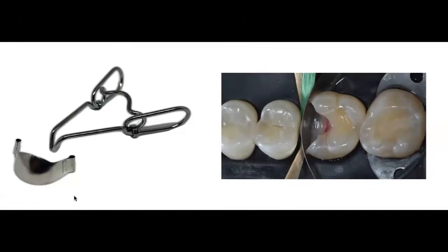You can see that the band has a gingival extension, which is great because it's a lot easier for you to get to these deeper margins. But then I needed to use, as you can see there, multiple wedges to secure the band in place. So I wasn't able to use the actual holder for this saddle matrix, but I was able to customize a way of keeping the band in place by using multiple wedges.